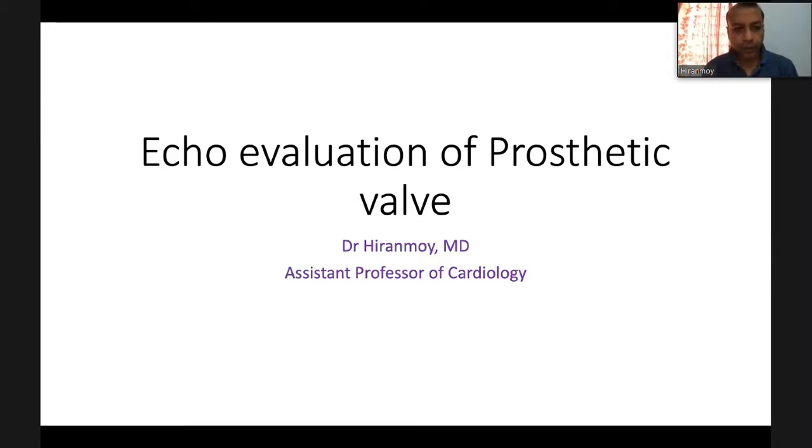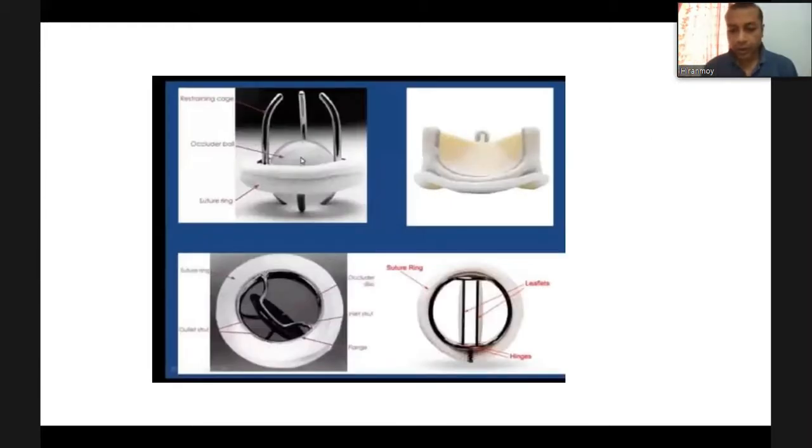Today I will talk about echo evaluation of prosthetic heart valve. Before you do an echo evaluation of a prosthetic heart valve, you must have some knowledge of the type and pattern of prosthetic heart valve which is available in your lab. So first, the types.